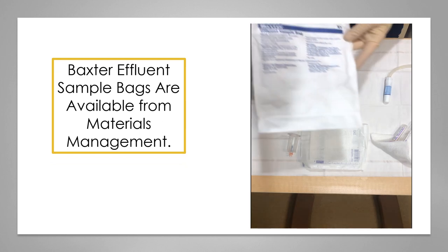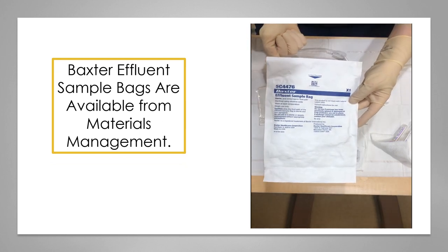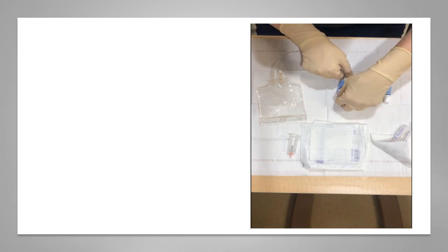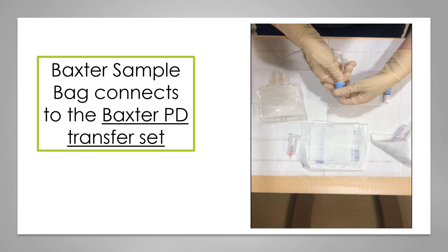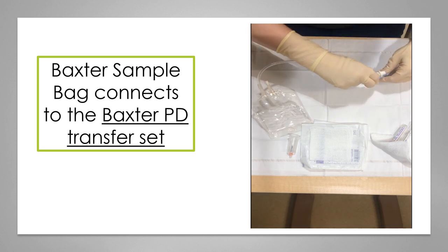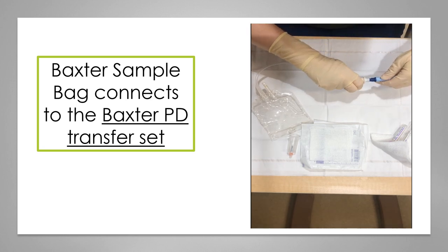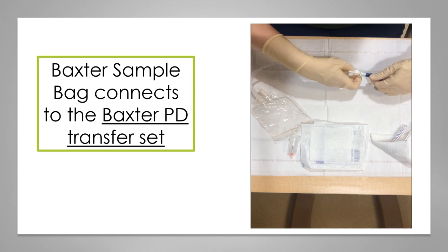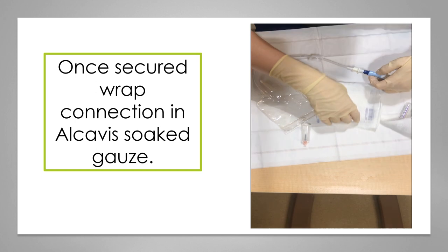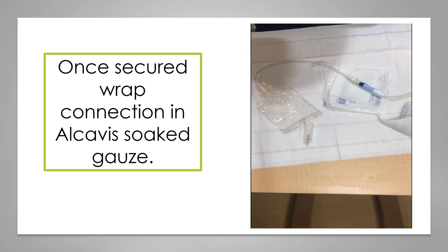The Baxter sample bags are available from Materials Management. The Baxter sample bag connects to the Baxter transfer set. Once secure, wrap the connection in Alcavis-soaked gauze.